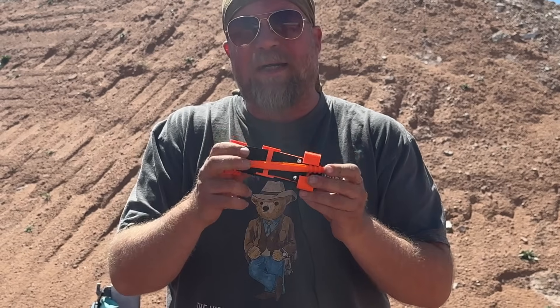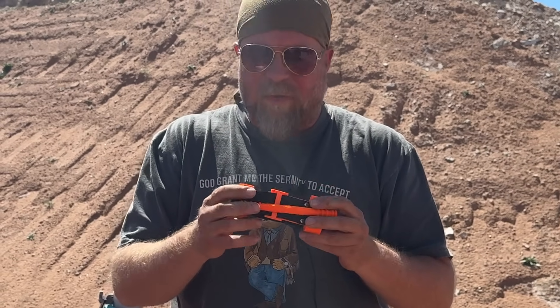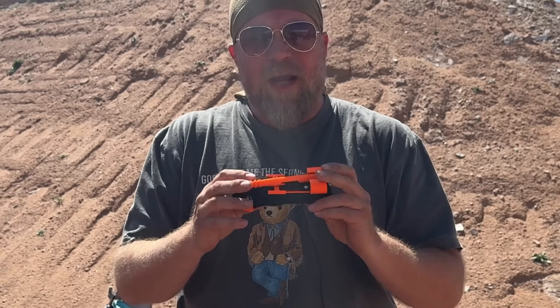So a tourniquet that can be applied to anyone at any time is a really relevant design, and they're doing this with 3D printing and just stitching. In 2022, a batch of these was actually shipped to Ukraine as an act of solidarity.